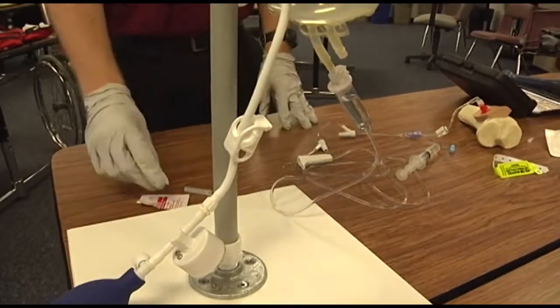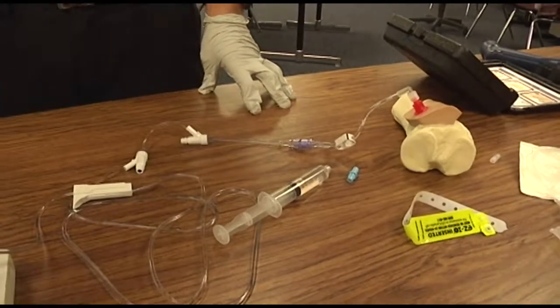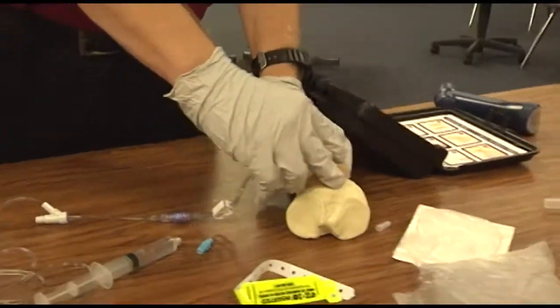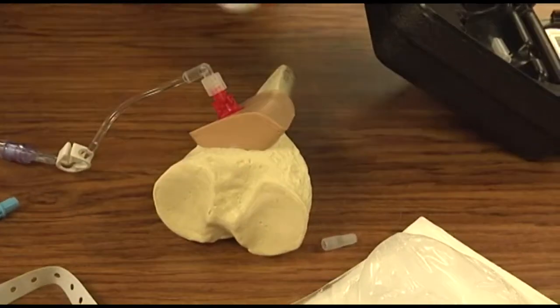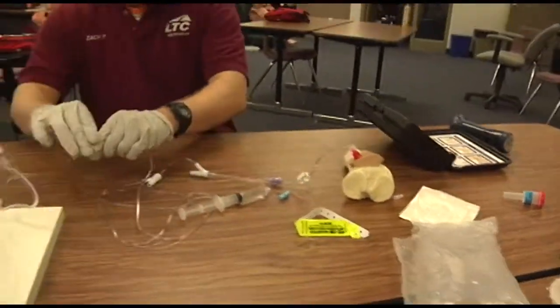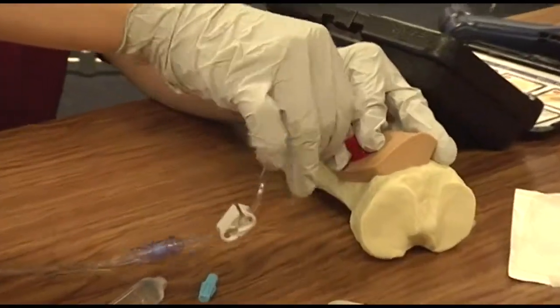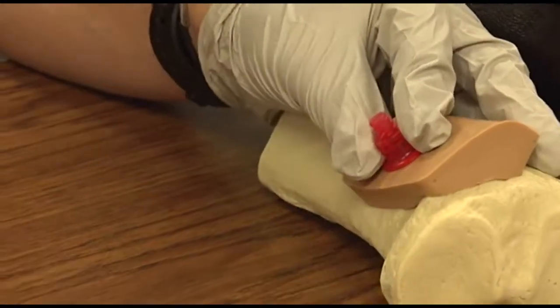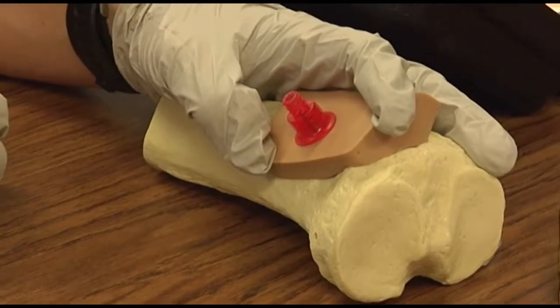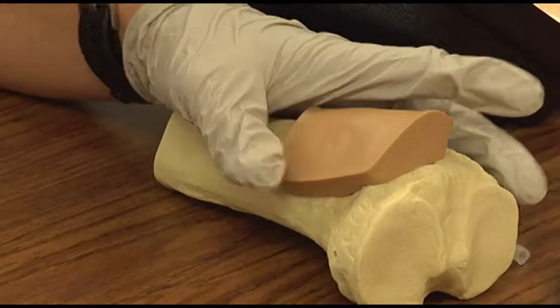Dispose of the needle properly. Explain stabilization and removal techniques. For stabilization, you could use bulky dressings — bulk up on the sides of the device and secure that down with tape. For removal, if it needs to be removed, disconnect your extension set from the hub, then twist clockwise as you pull straight out.